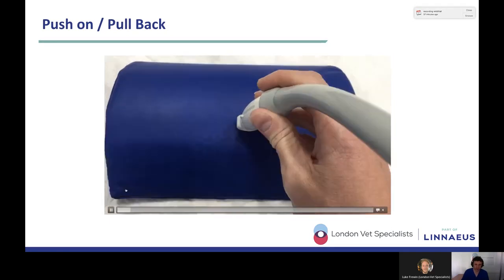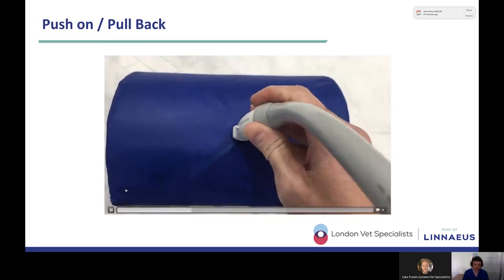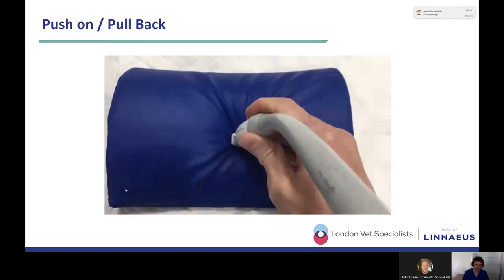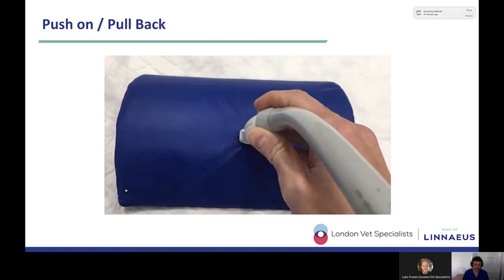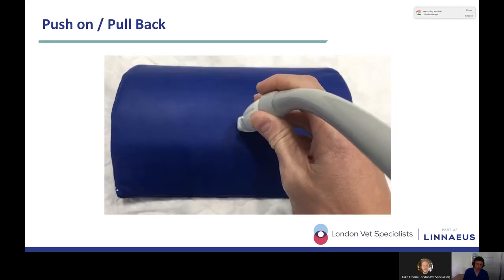And essentially, the probe isn't moving. All you're doing is you're pushing harder, you're easing off. So you're pushing on and you're pulling off. You're not rotating it, you're not sliding it, you're just increasing or decreasing the amount of pressure that you're applying to the probe. And that's going to help you examine deeper structures, like the left adrenal, for example. So push on, pull back.